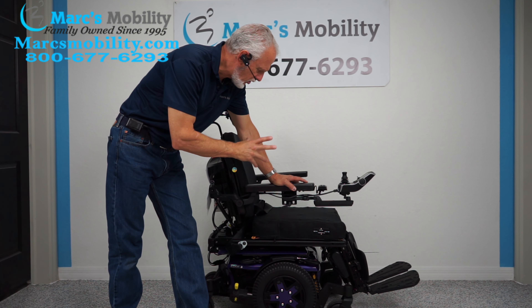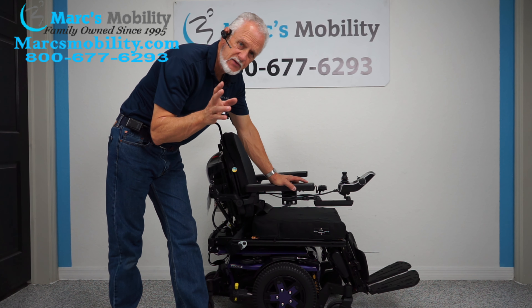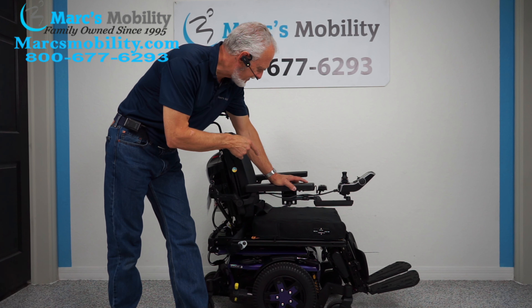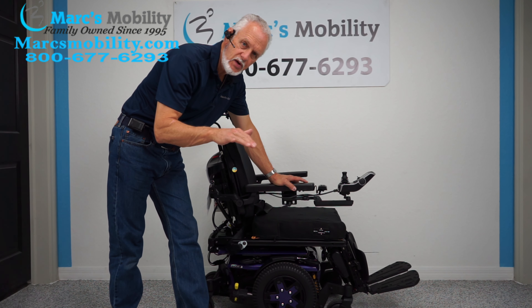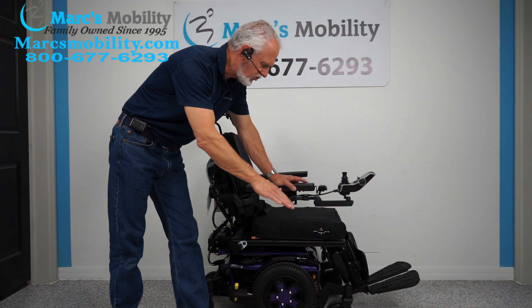We have here a Quantum Edge 3, practically brand new. This chair has 3 miles on it — practically brand spanking new. It has a larger seat, so if you're looking for a Quantum Edge 3 and you need a larger seat, this one has a pretty large seat. 3 miles, fully loaded.